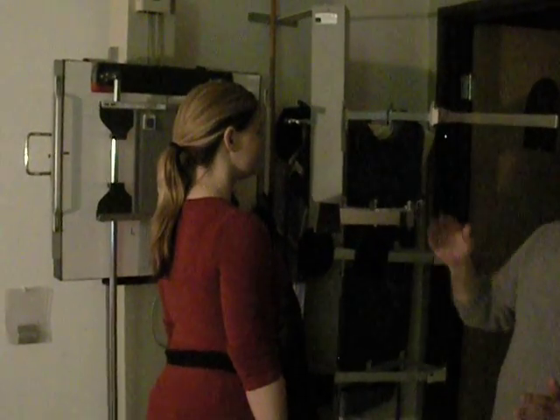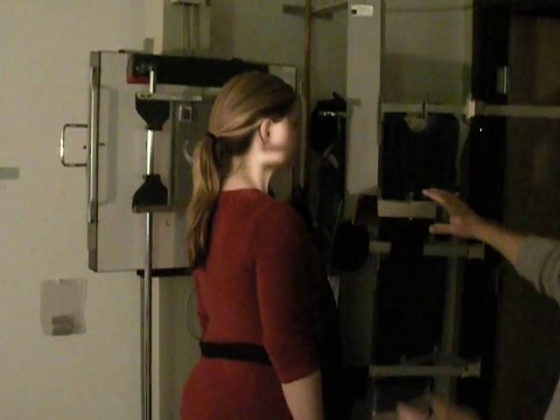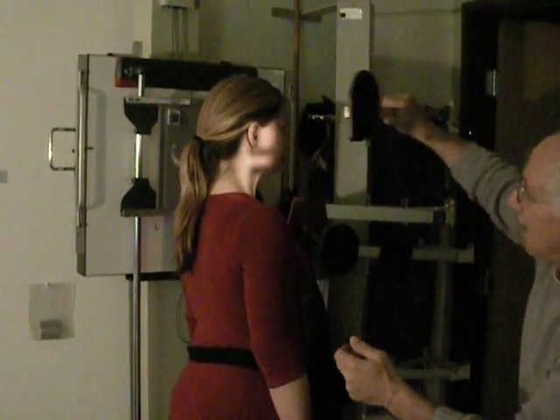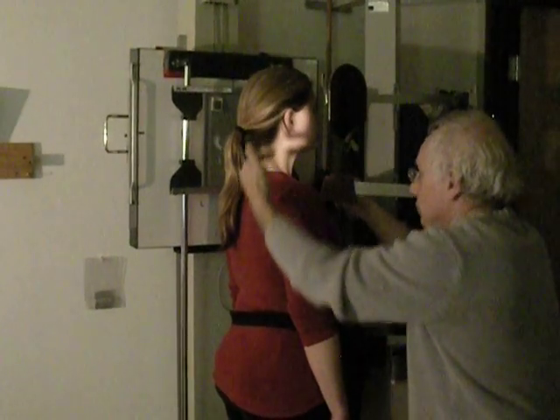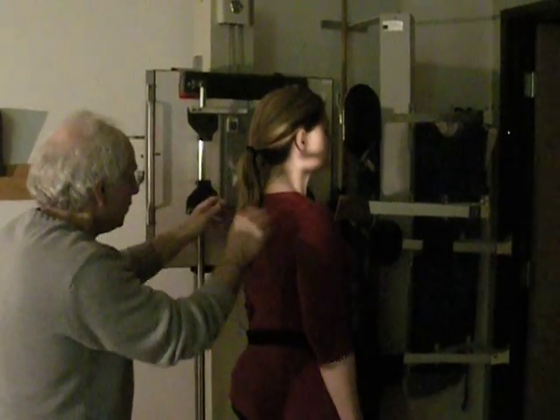And the eyes are straight, the sagittal plane is straight, the eyes are perpendicular to the film, the light, the thyroid shield is placed, the eye shield is placed. I'm going to put her in a neutral position. That same occlusal plane is now parallel to the floor. That's a nice neutral position. Last minute check, see C7 shadow in the field. Tell her not to move.